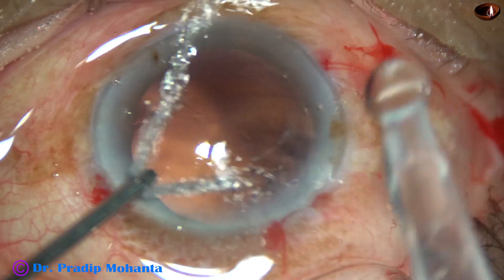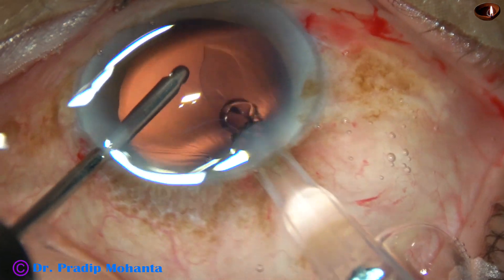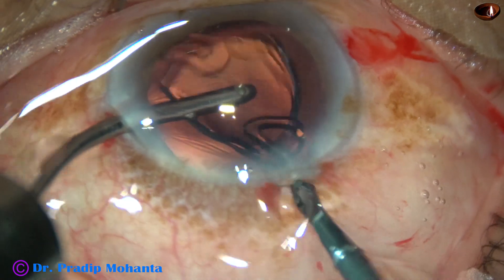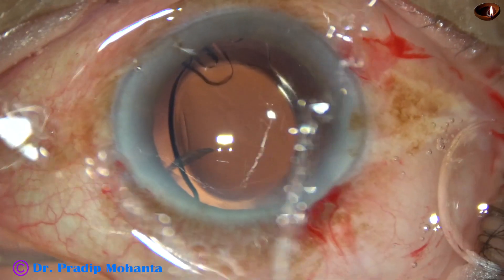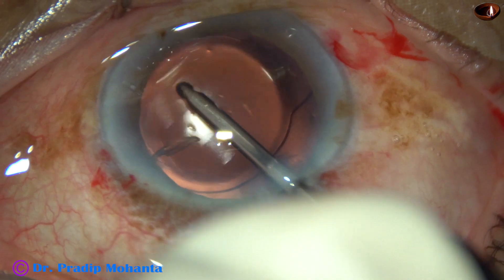And now this is hydro-implantation. The lens goes into the capsular bag. This is a hydrophilic acrylic single-piece monofocal intra-ocular lens. The lens has gone into the capsular bag. The irrigating probe is used to dial the lens.